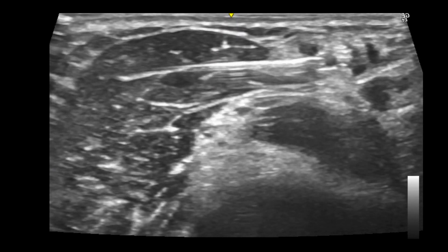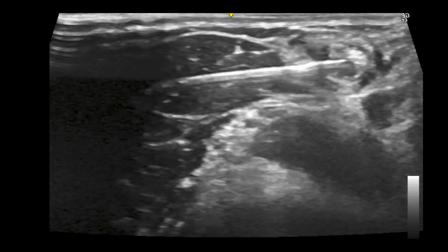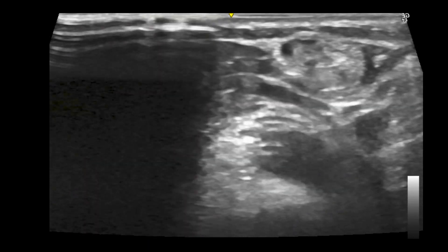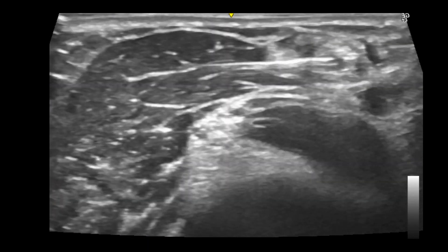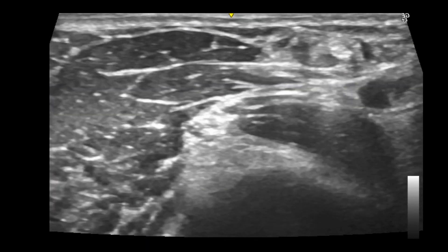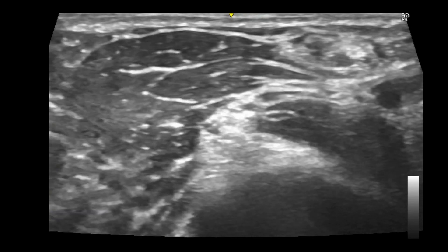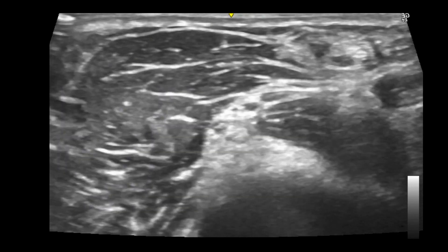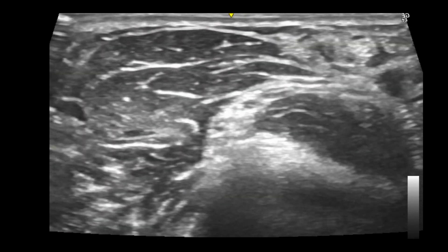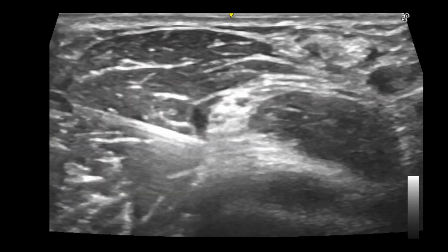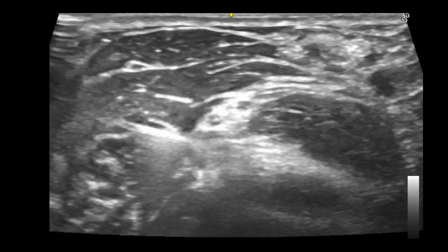That's just surrounding the lateral antebrachial cutaneous nerve. The needle is then withdrawn and goes through brachioradialis towards the radial nerve, popping into that little space around the radial nerve.